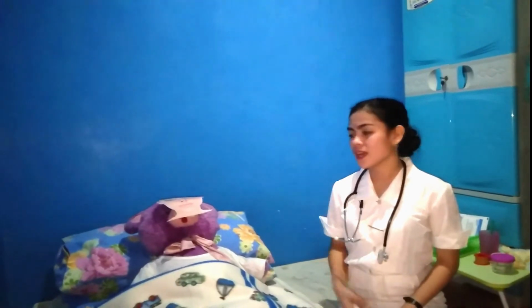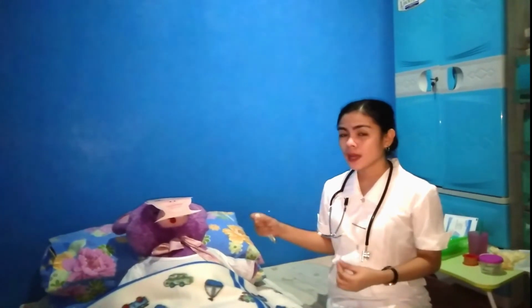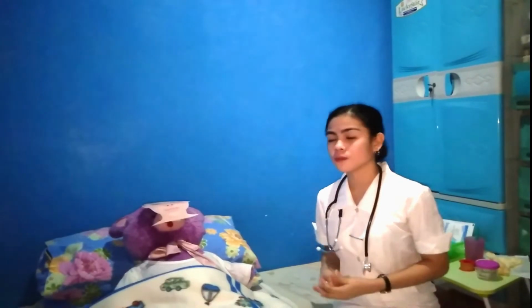After assessing if the client is able to cooperate with the procedure, we may need to measure the tube, whether the tube needs to be put in the suction or in the bedside bottle.